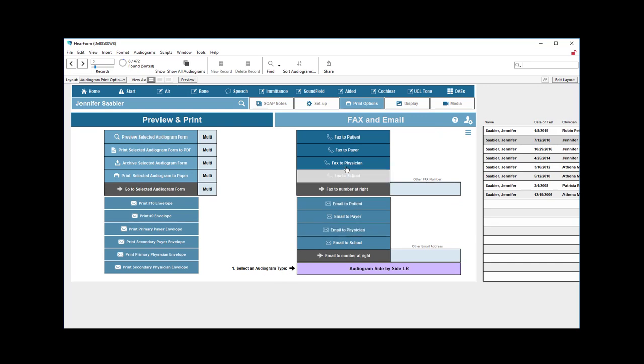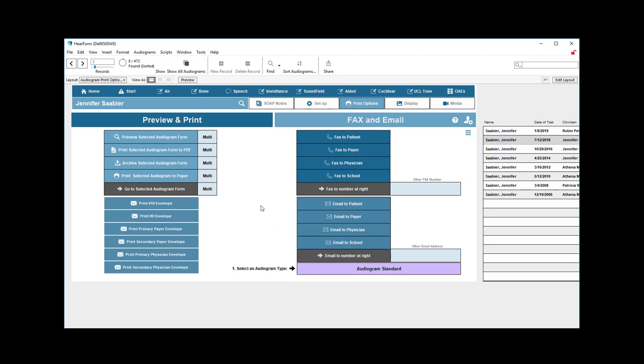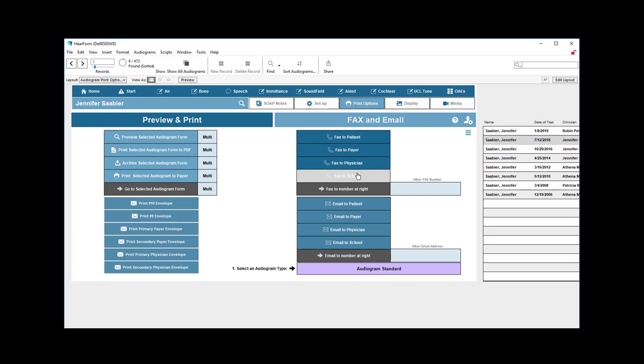Over here I can fax an audiogram of my choice, which I'm going to choose right down here. Let's say a side-by-side left-right audiogram versus a right-left or a custom or anatomy of the ear. I'll choose the standard audiogram here. And I can fax that right to the patient, to the payer, physician, school, or enter a telephone number right here, and that will automatically go to that fax number.